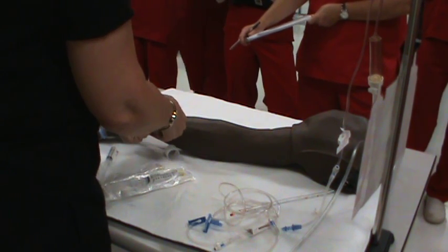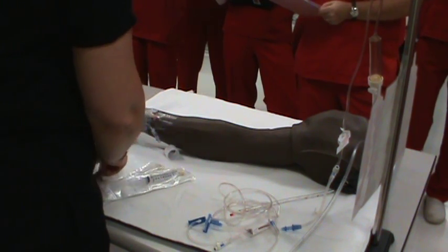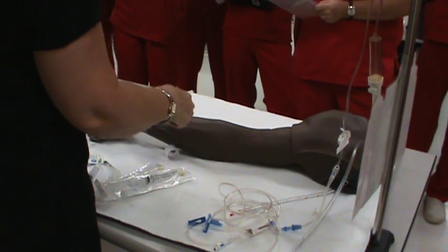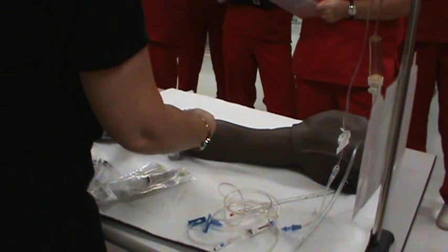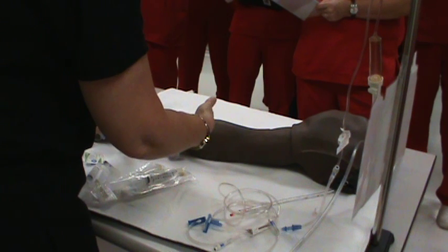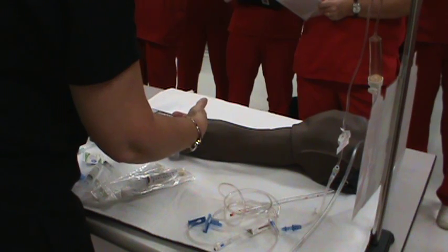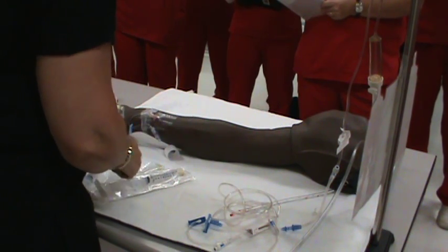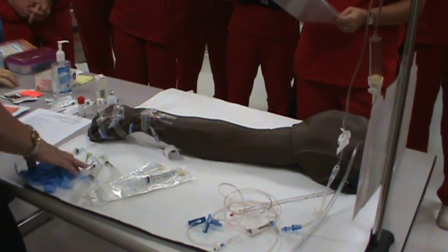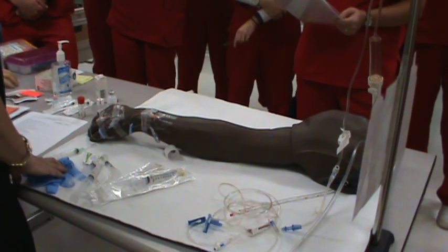Attach the saline, and then clean this, and then your saline. And then 2 to 3 mLs at the same rate. So as you're finishing, you're down to 3 mLs, you put that in, and you're still pressing on this, fumbling with this, and you're sliding your clamp, and that's creating a back pressure here, okay? And again, you're looking at your patient, how's the patient tolerating this? Are they still talking to you? It's a big thing. Okay?